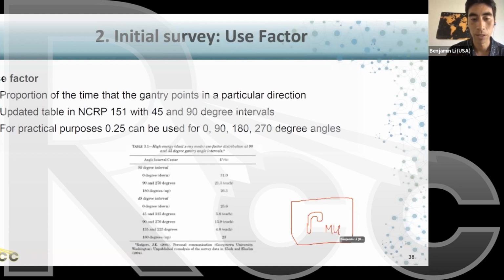So you may need to check whether the shielding that I have is adequate now that my machine is producing more MUs. You'll have your shielding, and then your public area on the other side, and you'll want to reassess your calculation and ask, is it still safe over here? If you find that it's not, you may need to take action, as Tomi is mentioning.